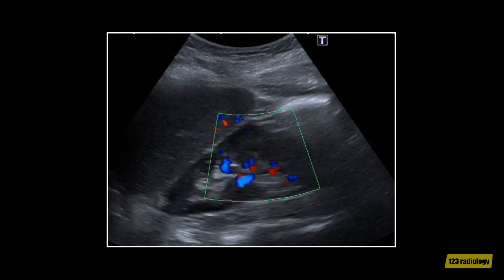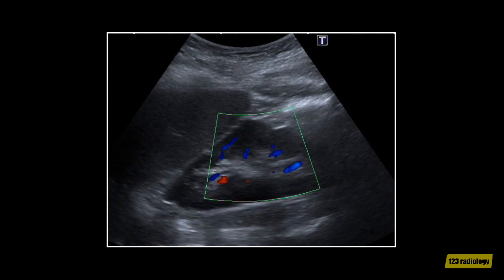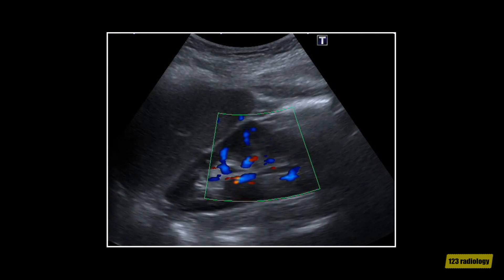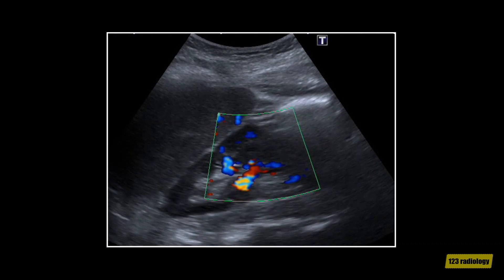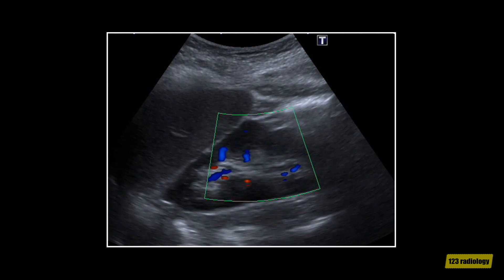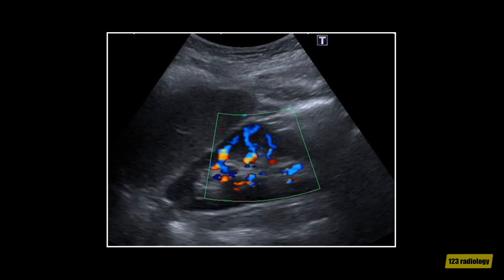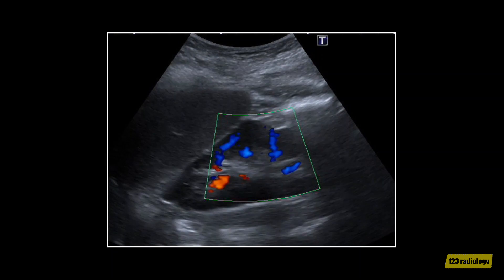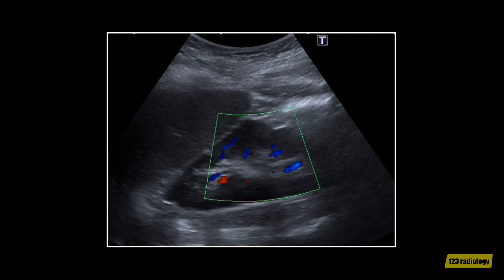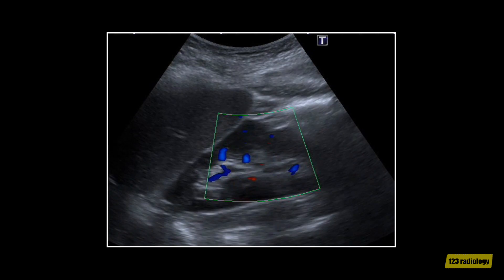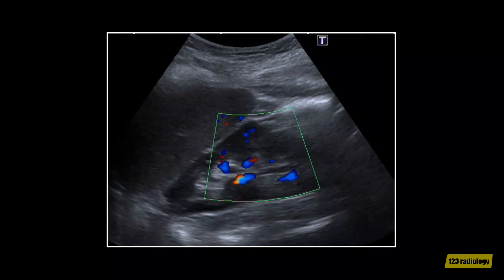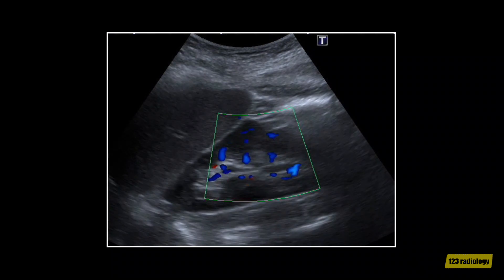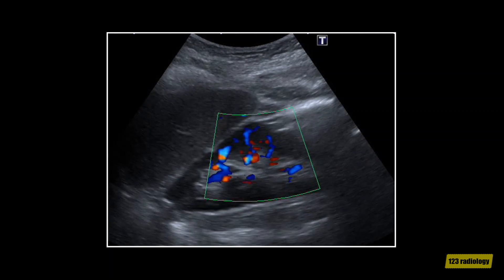This is another video clip of the same case. On color Doppler ultrasound, the dromedary hump demonstrates a normal vascular pattern of the renal cortex within the hump. Doppler ultrasound can help to differentiate a dromedary hump from a true renal neoplasm.